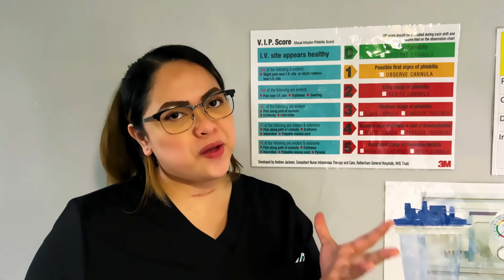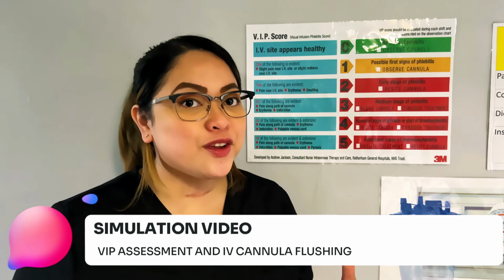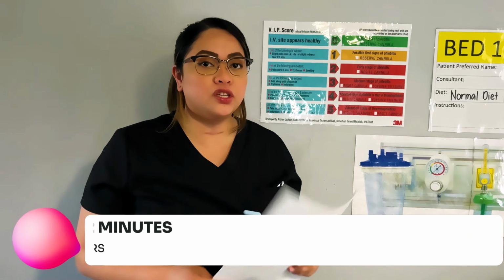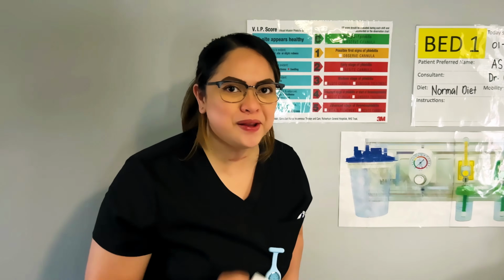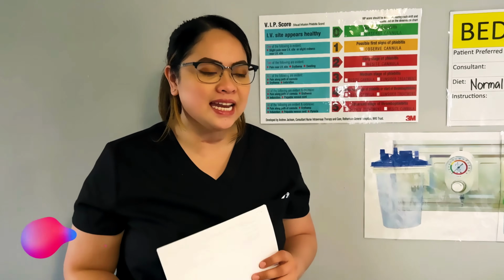We've come now to the favorite part of this video. We're gonna do the live simulation. Are you ready? Let's go! So with this station, you have got 12 minutes. You will be given a prescription since we are doing a hospital prescription. So it looks like this. It looks like your implementation prescription, the same booklet.